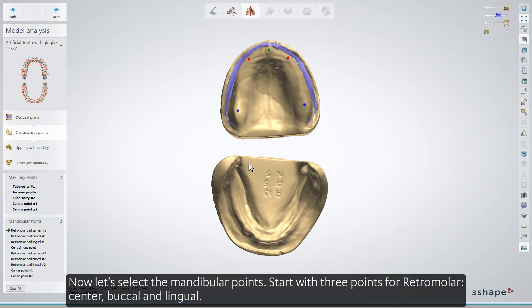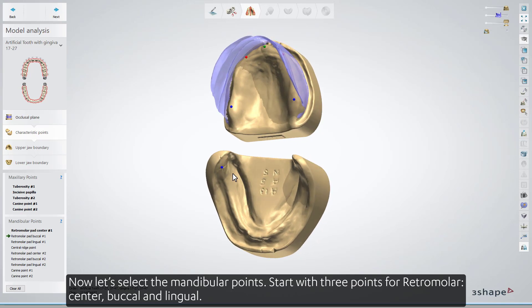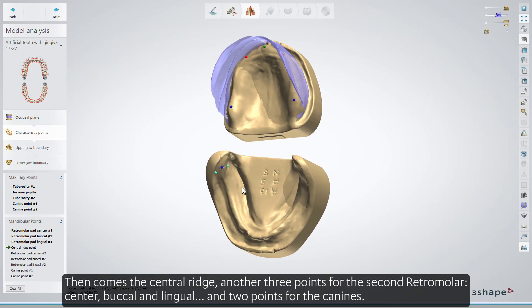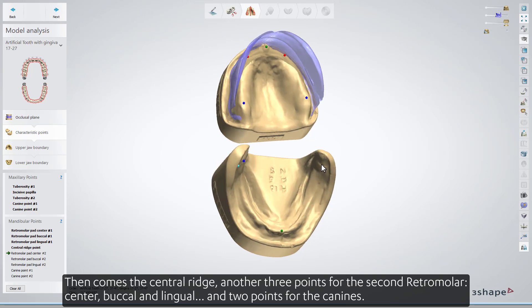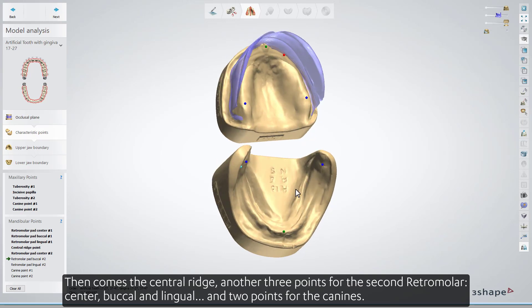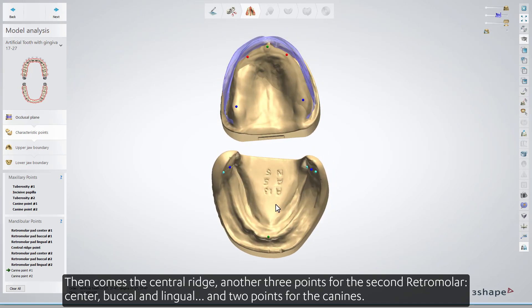Now, let's select the mandibular points. Start with three points for the retromolar: center, buccal, and lingual. Then comes the central ridge. Another three points for the second retromolar: center, buccal, and lingual. And two points for the canines.